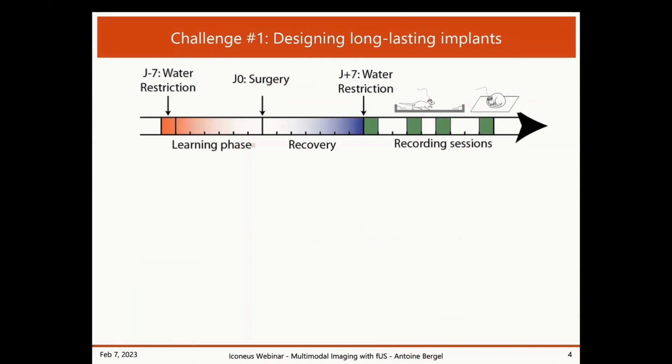Challenge one, of course, is designing long-lasting implants. We do the kind of behavioral studies where we want to record and monitor brain activity across days, possibly weeks, and why not months. Most of the time, we have a learning phase where the animal learns a task. Most of the time, we do it before the surgery. Then there is a one week recovery period, and then you want to start your recording sessions. Depending on the difficulty of the task, these recording sessions can span a very long time.